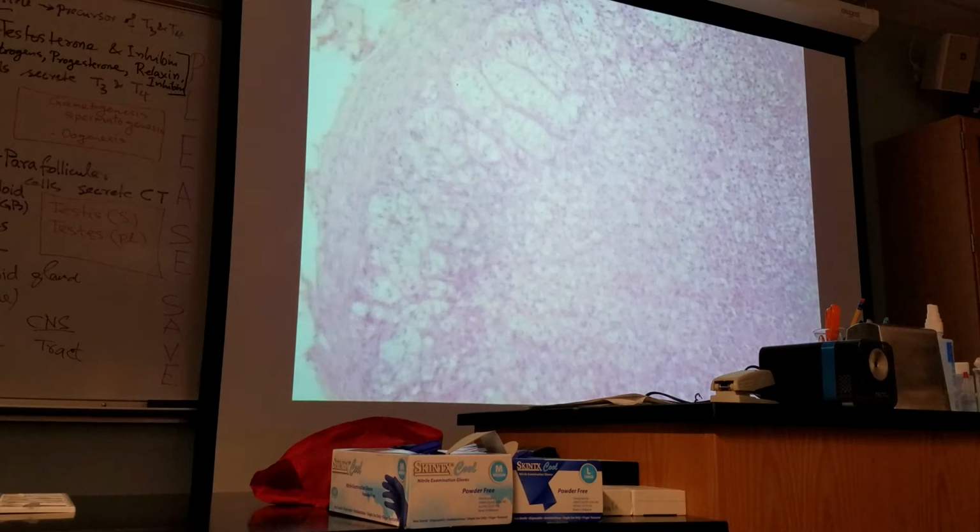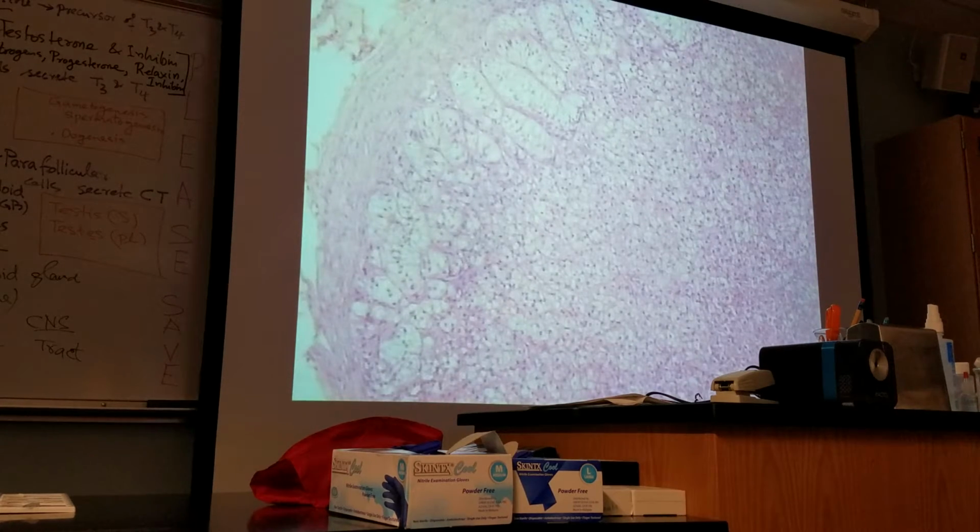Go to the outermost region of the adrenal gland, and the easy landmark is this arrangement of cells in the zona glomerulosa. Yeah? So-called mini hot dogs. They're not, definitely. Is there any such term like mini hot dog or mega hot dog? No. This is zona glomerulosa. This is the capsule of the adrenal gland.